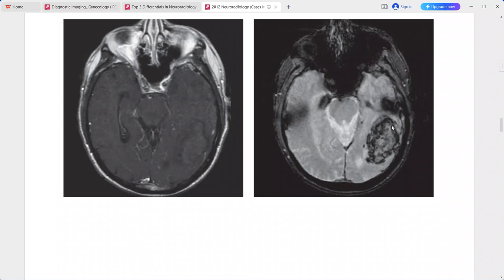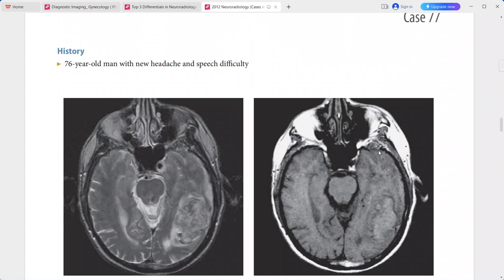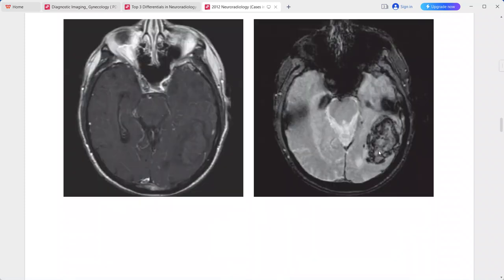On gradient echo or T2-star-weighted sequence, there is a peripheral hypointense rim surrounding a partially isointense center. This is a typical imaging presentation of hyperacute intracerebral hemorrhage. Differentials include primary intracerebral hemorrhage (hypertensive bleed or cerebral amyloid angiopathy), hemorrhagic tumor, vascular malformation (AVM or cavernous malformation), venous sinus thrombosis, and vasculopathies.